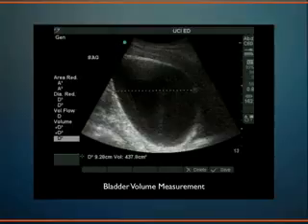Somebody who has an enlarged prostate, they think they've emptied their bladder, but instead we have 400 cc's left in the bladder after somebody attempts to void their bladder. Well, their post-void residual, 400 cc's, that's a lot of good information to pass along to a specialist like a urologist. And we can also measure their prostate too on bladder.